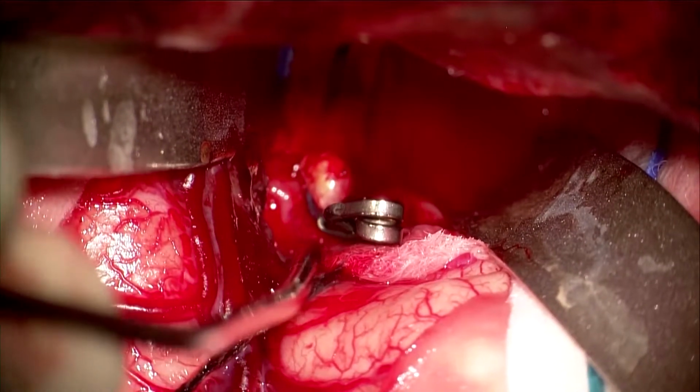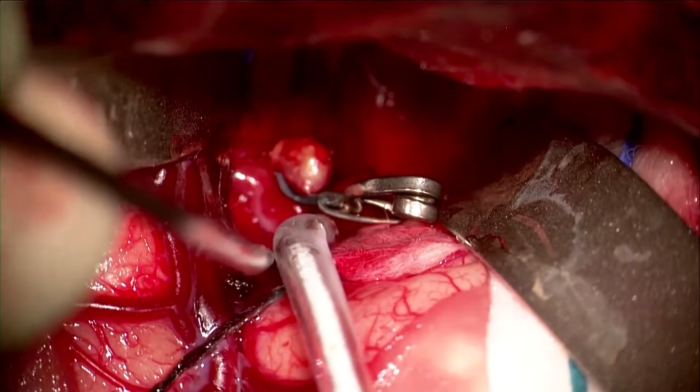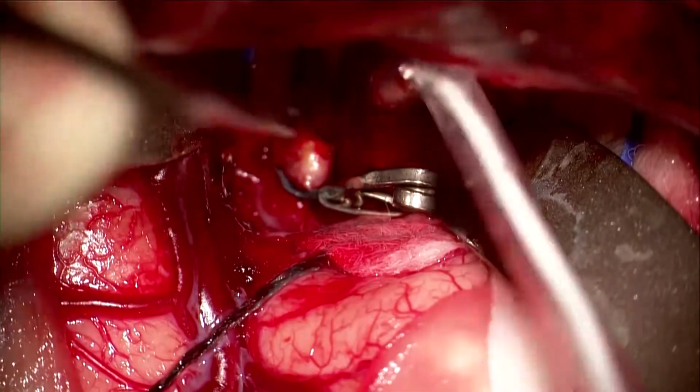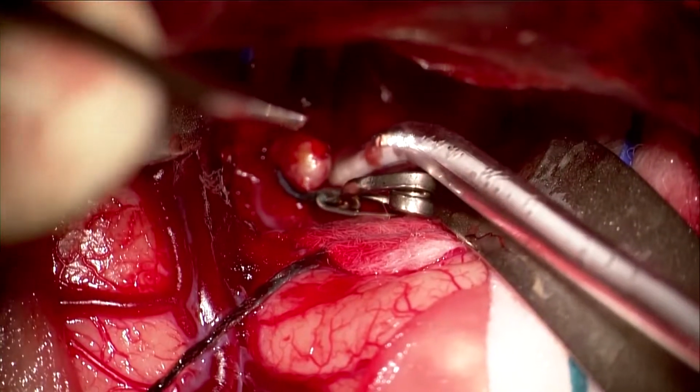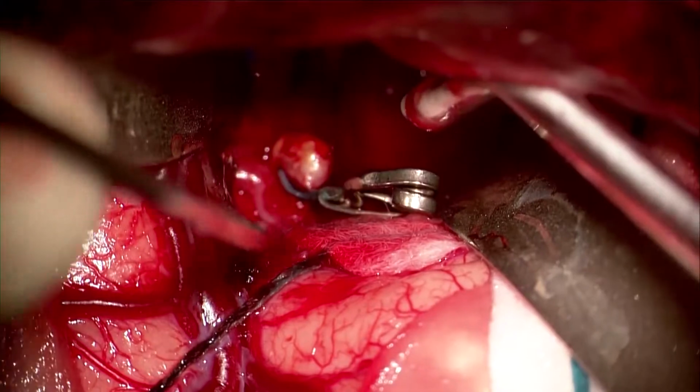After the clip has been placed, you need to verify that all of the other vessels are still patent and flowing, and this is performed by one of several methods. This is the microdoppler, which tests the blood pulsations that you can hear audibly. This is a separate intraoperative picture that you get with the microscope where you inject a certain dye and the vessels light up, and anything that does not receive dye will stay nice and dark.